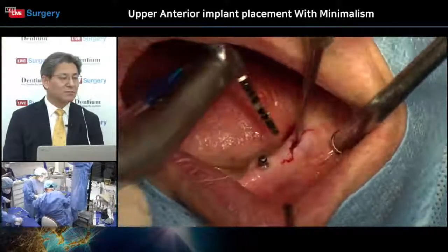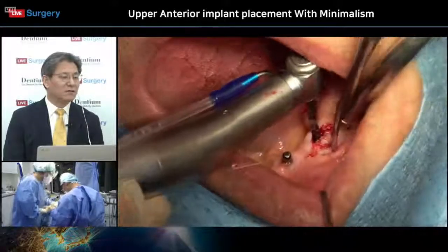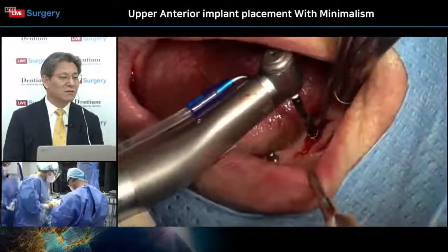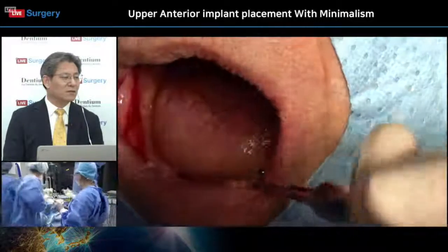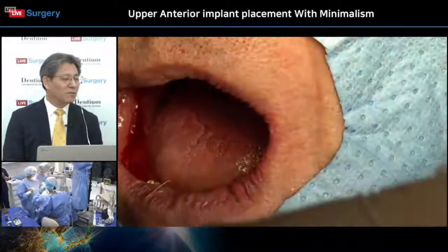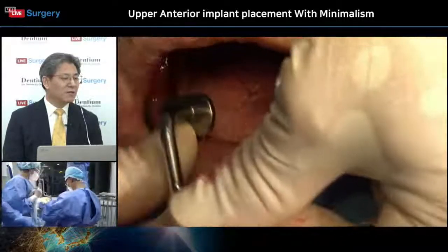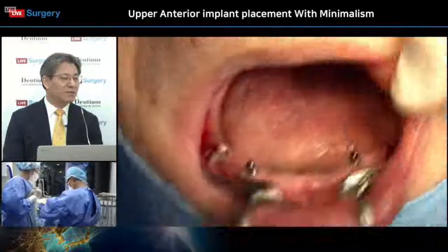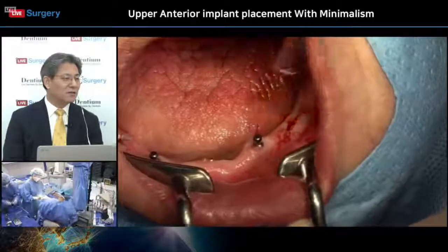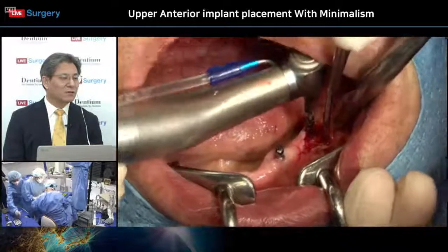But the left side is very good inside the bone housing. So maybe I can... Turn your head slightly toward the right. Yes, keep looking that way. Good. Or should I turn the whole thing? Wait. So, bone shape and bone profile are better than number 46. This area is better than number 46. So, Dr. Jung is... Are you okay? Starting the drill. It'll be done shortly.